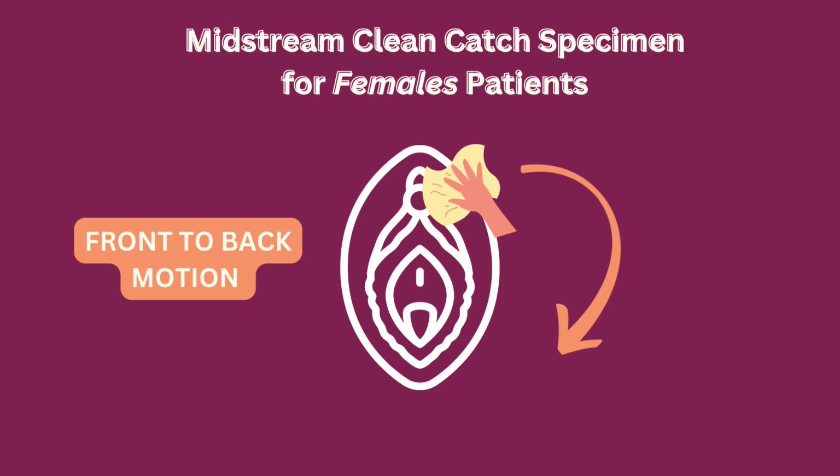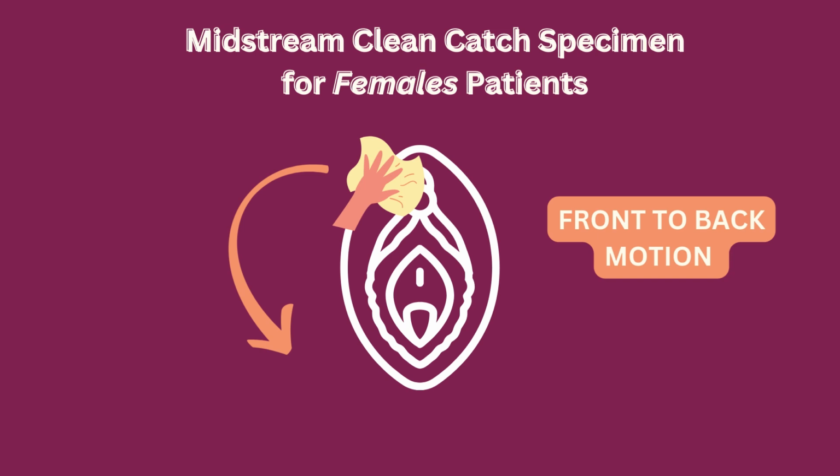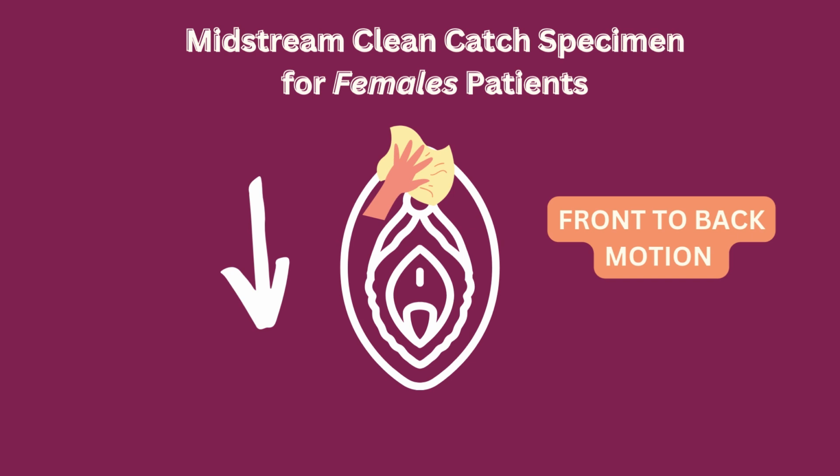They will expose their urinary meatus by spreading the labia apart with one hand, and with the other hand cleaning one side of the meatus using a front to back motion in order to avoid drawing microorganisms into the clean area, and discard the used wipe. Then repeat the same thing on the other side of the urinary meatus. Next, cleanse directly across the meatus with the third antiseptic wipe.